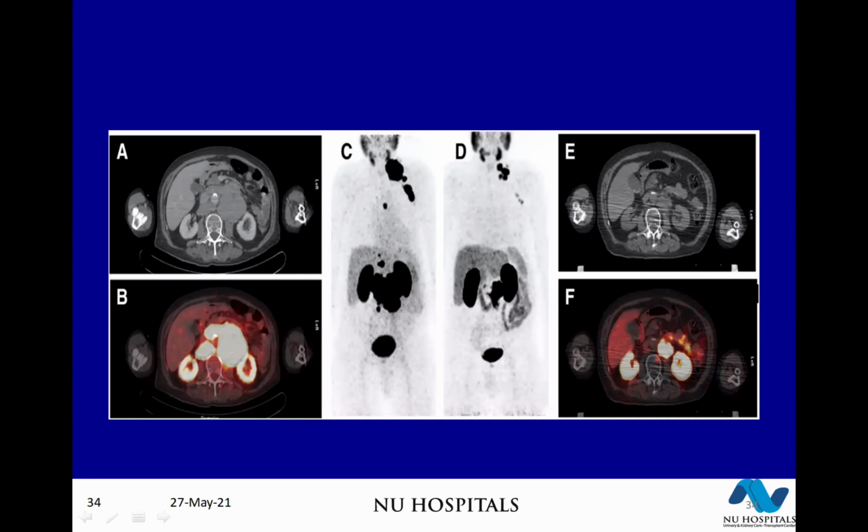Karunakar, you know that first image, sir. Don't call it a huge lymph node. It's a lymph node mass. Again, some finicky examiner will say you think it is one lymph node. Yes, it's a lymph node mass. Obviously, they are matted together, which the PSMA PET scan, if you see, has actually picked up at least 3 discrete masses. Yes, sir. Correct.